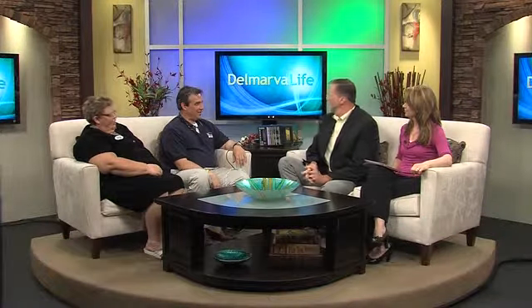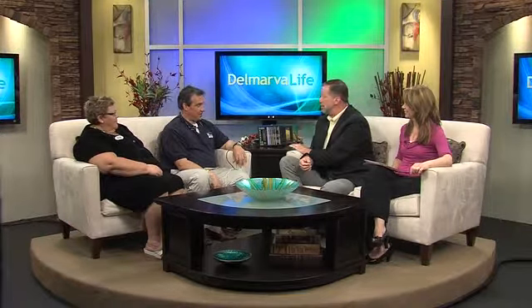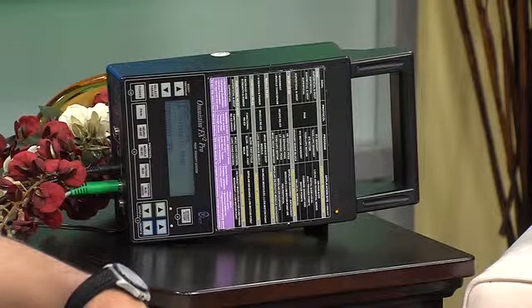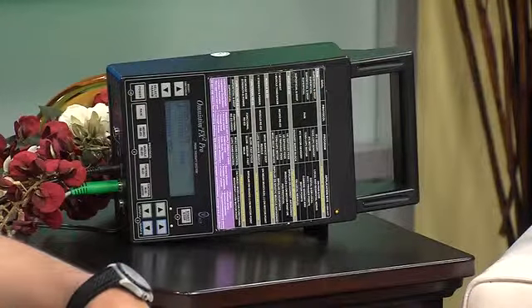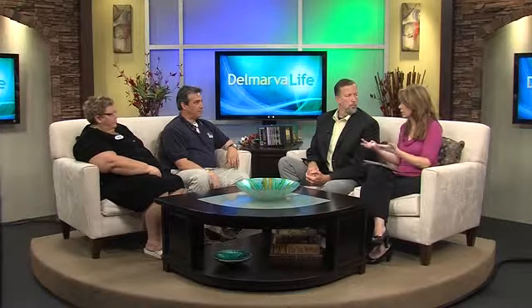Thank you guys for coming in this afternoon. Now, you brought a little toy here. This is called an E-STEM device — it's an electrical stimulation unit. It actually transmits waves to the muscle, hundreds of waves a minute, and it helps relax the muscle, stimulate the muscle, and brings blood flow to the muscle. It relieves pain — a lot of uses. We mentioned pain relief, but it also helps with other things, like retraining the muscle.